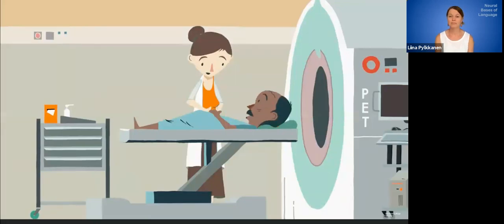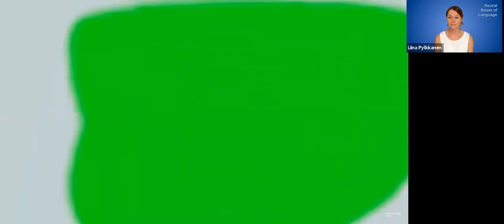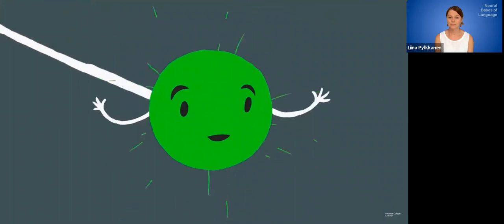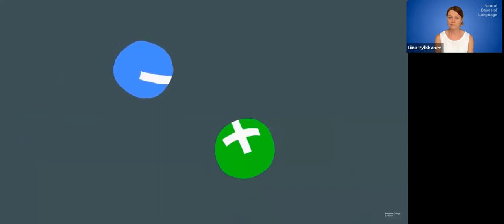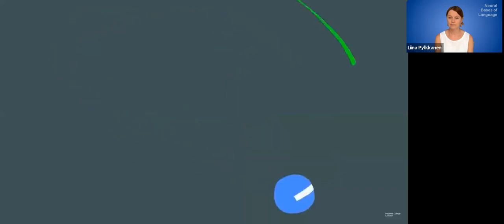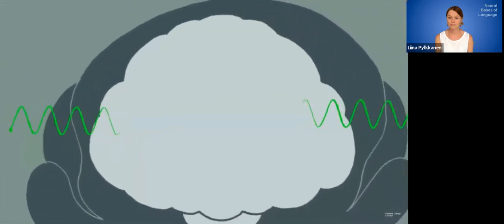There'll be a sharp scratch. It's not long before Dave's brain has absorbed the tracer, and the clever chemistry gets to work. Inside Dave, an incredible reaction is taking place. The radioactive atom on the tracer loses its radioactivity, giving off a subatomic particle called a positron. It's just like the tiny negatively charged electrons found on all atoms, except that the positron is positively charged. So when the positron hits an electron at just the right speed, they combine and destroy each other. The energy is released as 2 gamma rays that travel straight out of Dave's body in opposite directions.